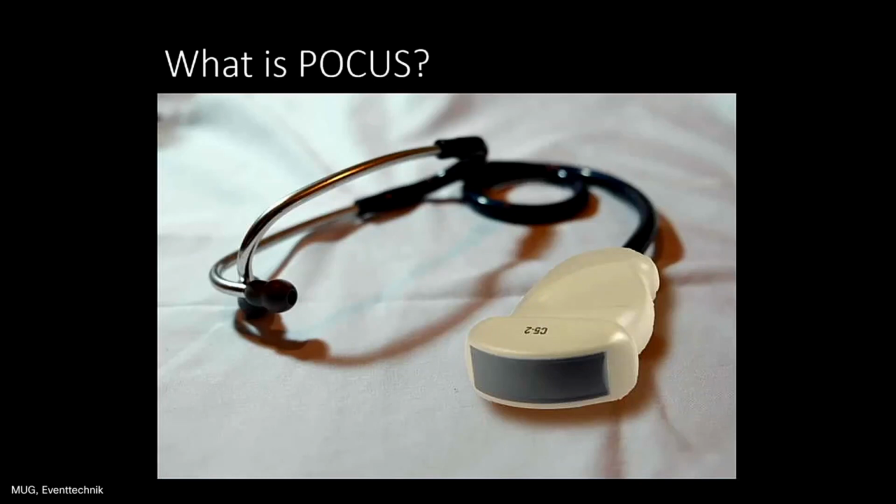So it's time to come to the last part of our presentation, to clinical application. So we want to present the POCUS to you. POCUS means point of care ultrasound. And this includes 2 messages. Point of care ultrasound is using the ultrasound machine anytime at the patient's bed, every day in your clinical rotations, and asking simple questions that you can answer mostly with a yes or no.